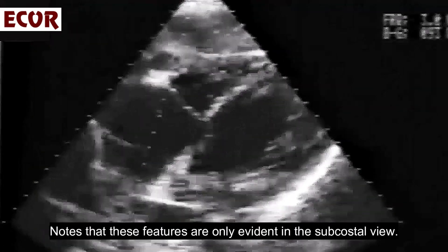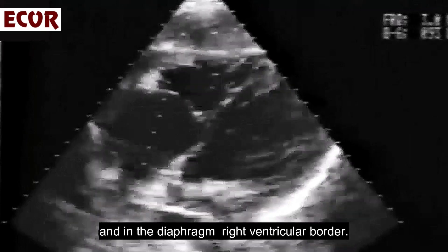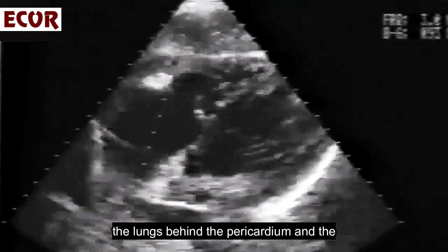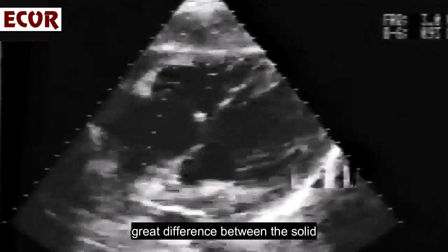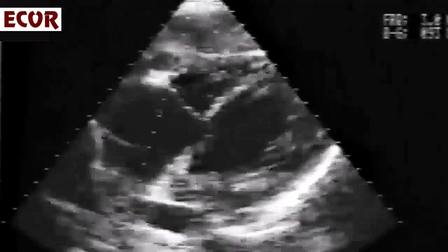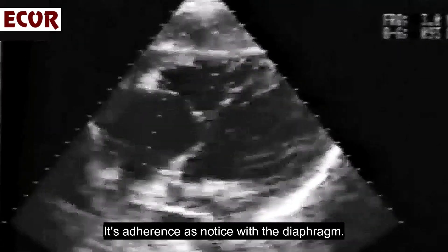Note that these features are only evident in the subcostal view at the diaphragm and right ventricular border. Any other echocardiographic views will show the lungs behind the pericardium, and the great difference between the solid pericardium and the air in the lungs makes it too difficult to notice the thickness of the pericardium. As well, there will be no structure to show its adherence as noticed with the diaphragm.